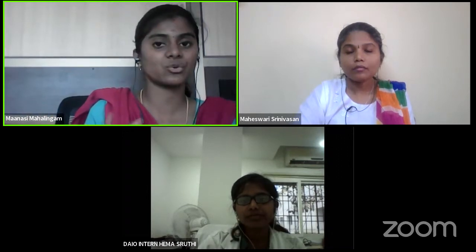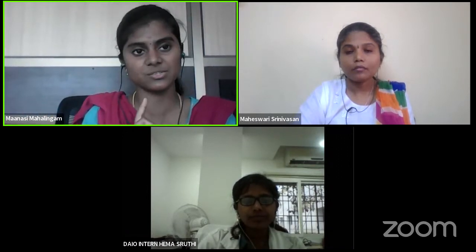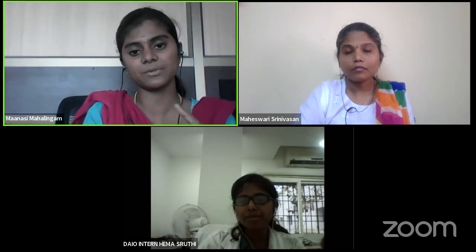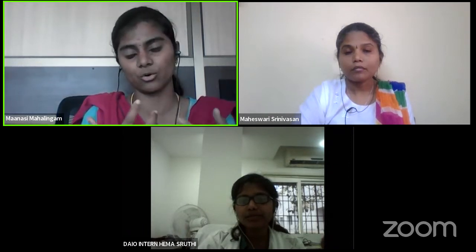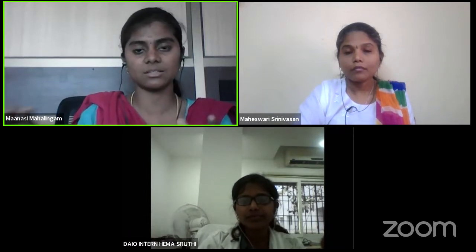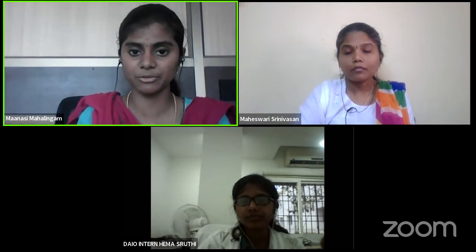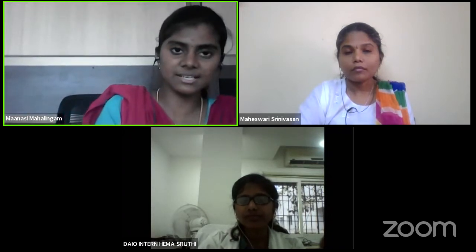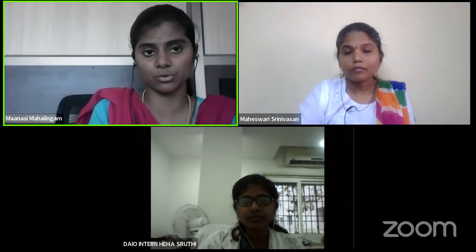So for those patients, OCT alone is not enough. We'll advise the patients to do OCTA or angiograms, FFA and ICGA, which will help us rule out whether the patient has pachychoroid or leakage, based on which the treatment modality will differ for ARMD and pachychoroid. So you can read about the pachychoroid spectrum. There are so many, like central serous chorioretinopathy, which you'll be familiar with. Those conditions come under pachychoroid, whereas ARMD has a thin choroid. So we should always see the foveal thinning, the thickness of the fovea, and also the thickness of the choroid as well.